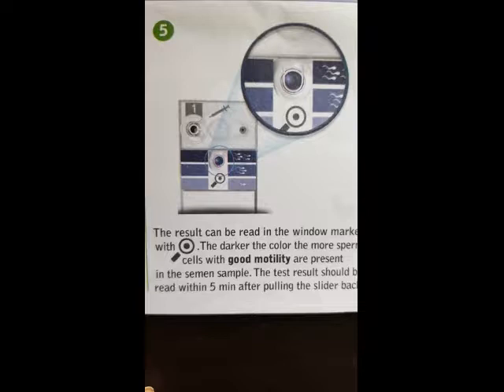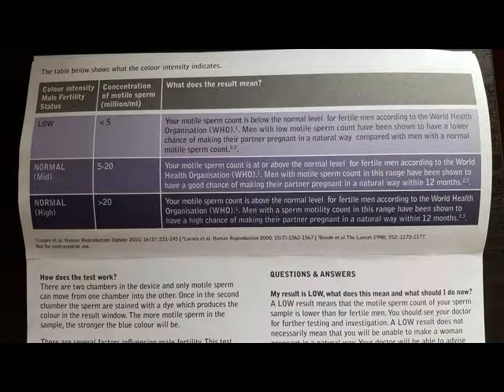The colour in the well now indicates your result, which you compare to the colour on the information sheet provided. If the colour is similar to the lightest purple, the motile sperm concentration is below normal — less than 5 million per millilitre. If the colour is similar to the mid purple, your motile sperm count is at or above the normal level of between 5 and 20 million per millilitre. If the colour matches the darkest shade, your motile sperm count is above the normal level at over 20 million per millilitre. The darker the shade, the better the result.